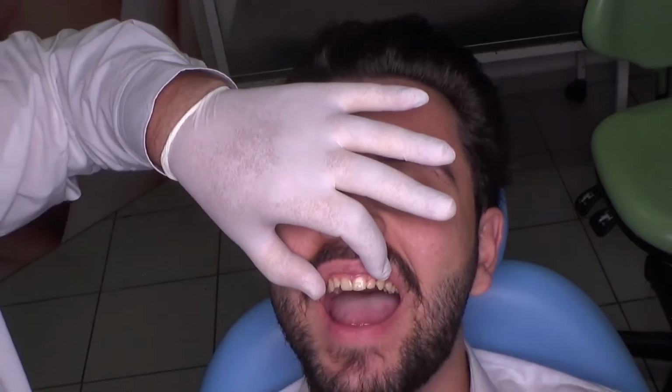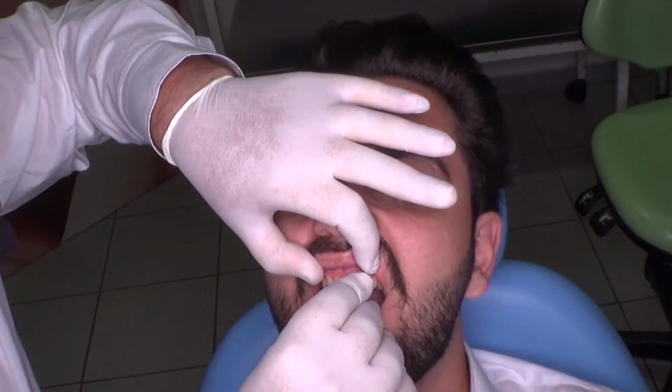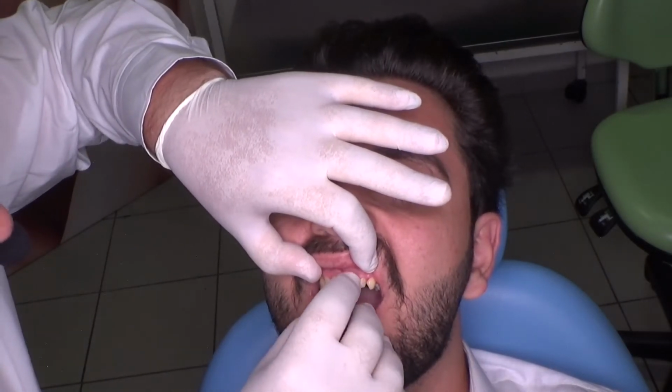You can work with your fingers, nothing special. Like this. And you place, air dry slightly. And you put a piece of composite on the central incisor.